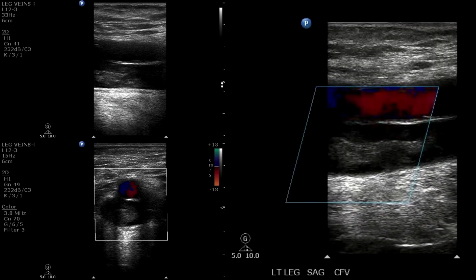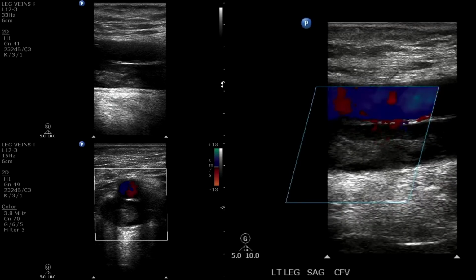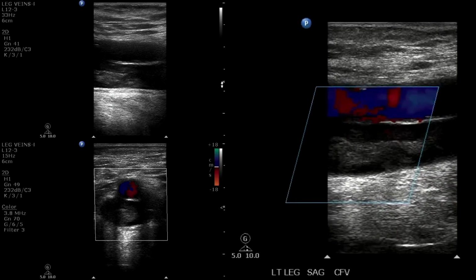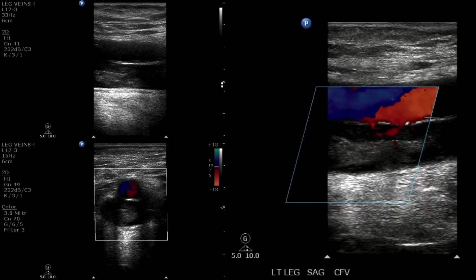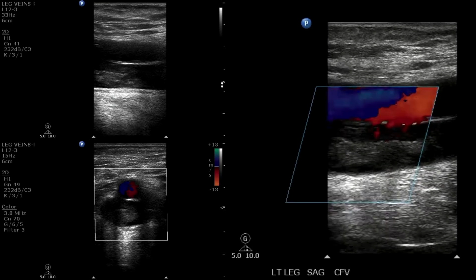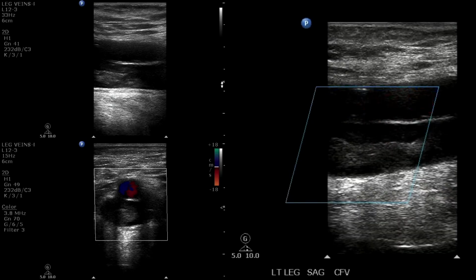We talked last week that there are multiple characteristics of DVT that we need to identify. One would be the fact that it's in the vein, so an anechoic, thin-walled, compressible structure. If we were to compress this and there wasn't a thrombus there, you'd see it completely collapse. But the presence of something that violates at least two of these principles suggests that this is a DVT.